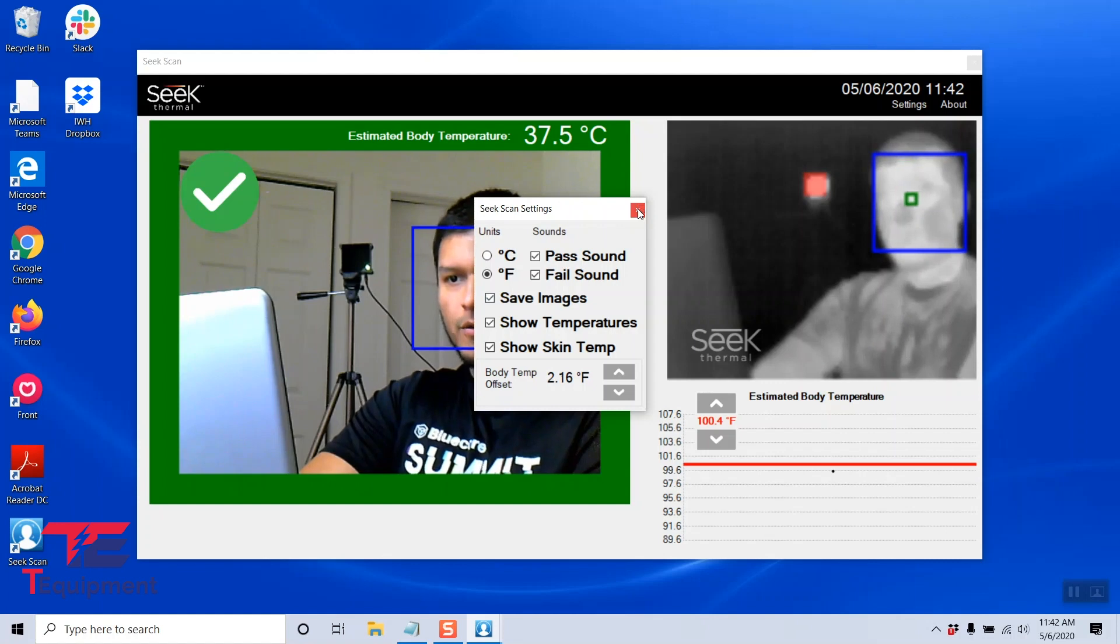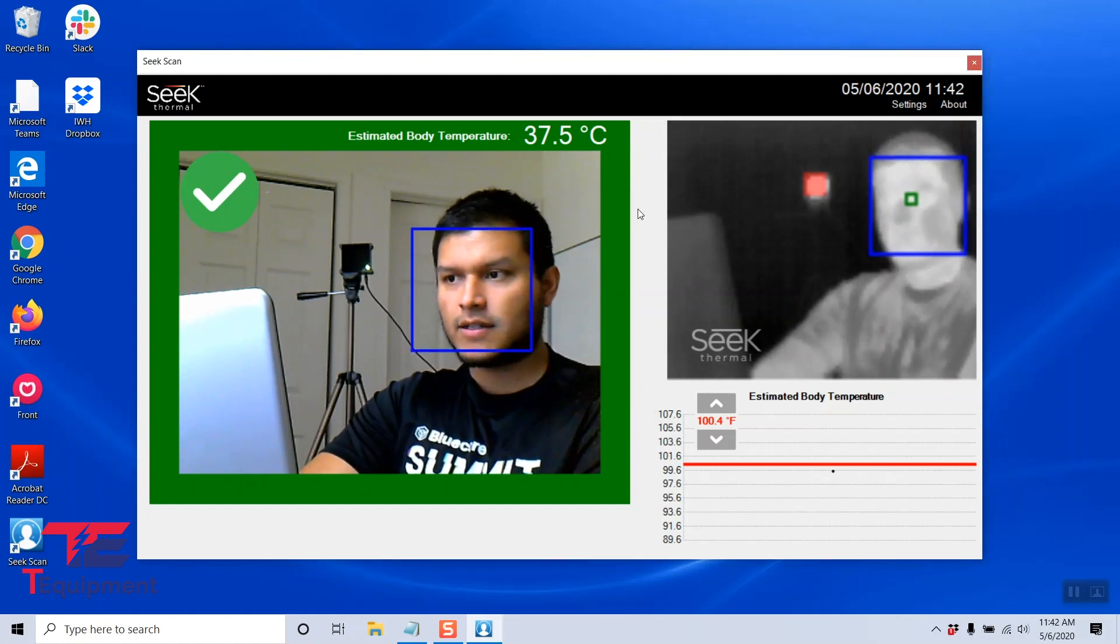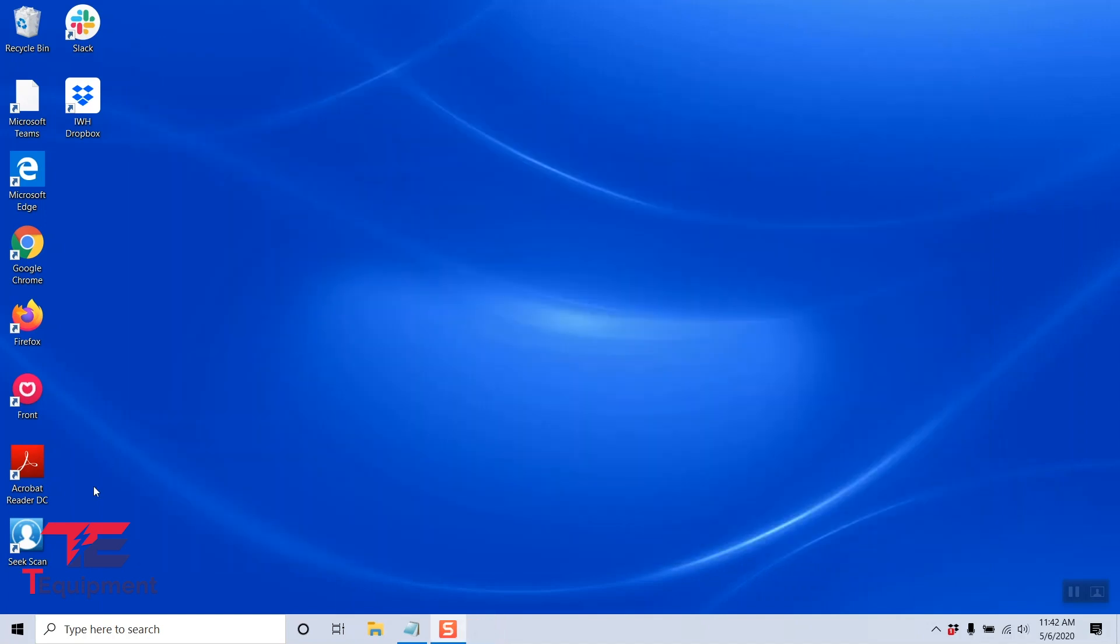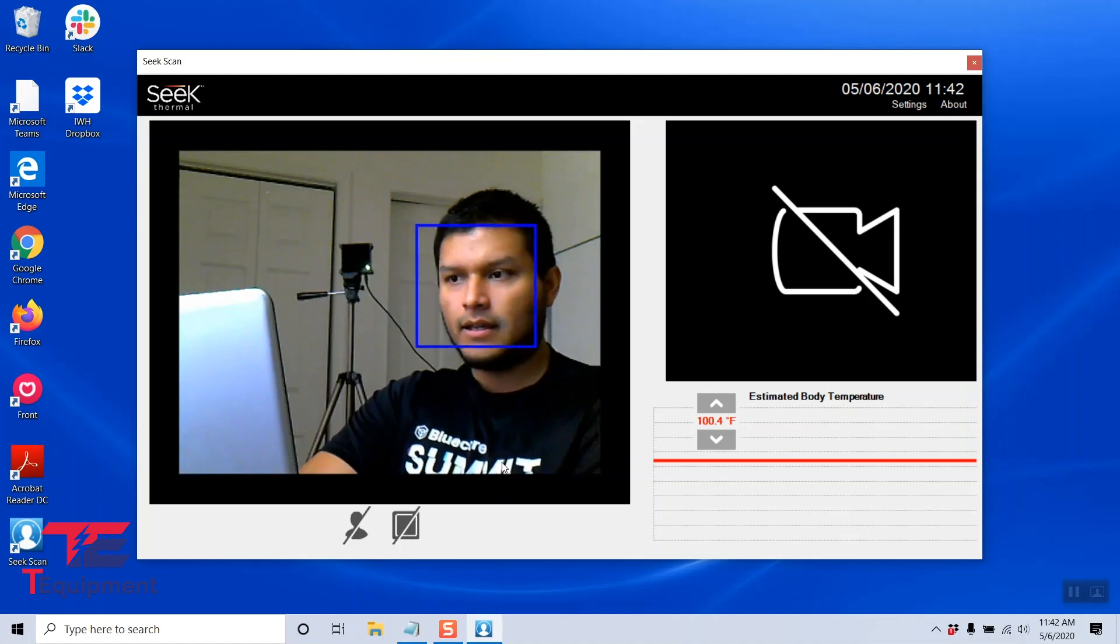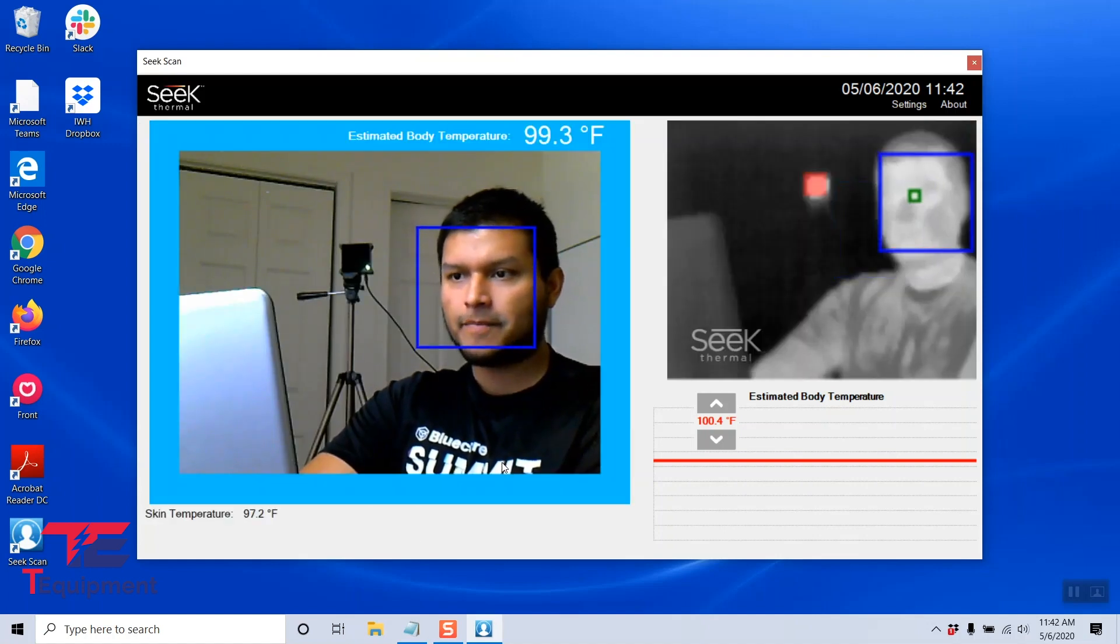I'm going to go ahead and close the Seek Scan settings, and I'm also going to go ahead and close the application. This will actually apply those settings. I'm going to go ahead and reopen this.